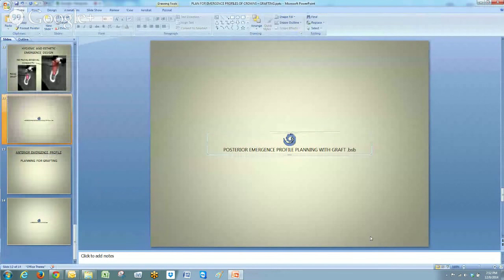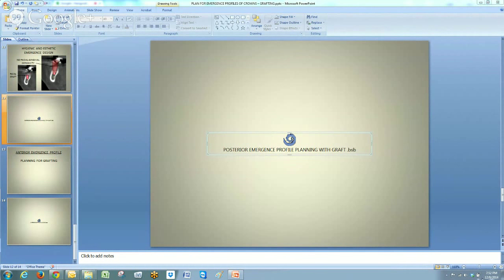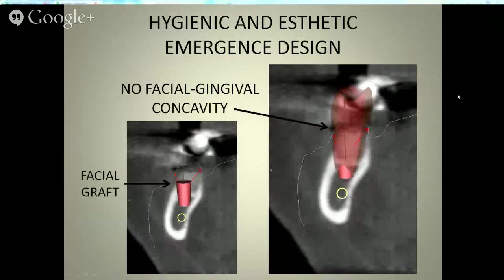Okay. What do you think about the relationship between the implant and the buccal cortex? Can the implant be compromised, meaning if it's too close to the buccal cortex? Yes, I believe that's what he meant. I think if you really look at what's being done in dentistry right now, grafting is done all the time. What you're asking is, are we going to get bone that dies back around the implant? And I think if you didn't graft this, that you would.